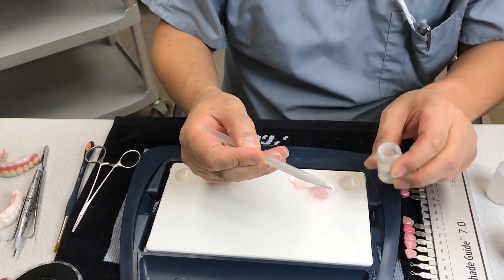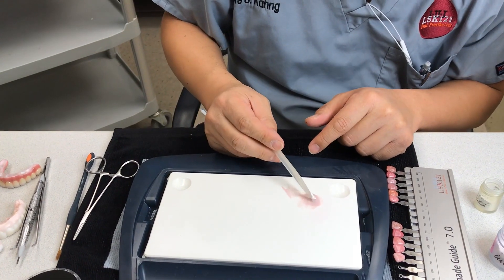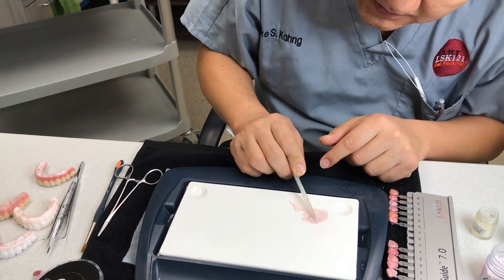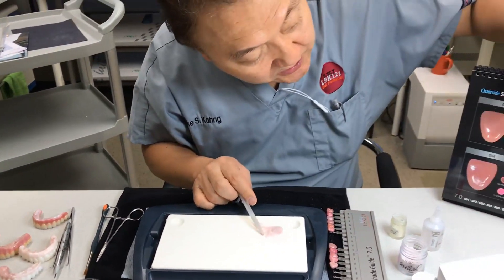It's a mixture — about 25%, or maybe 20%, compared to this. Mix it. Then I can achieve this color.